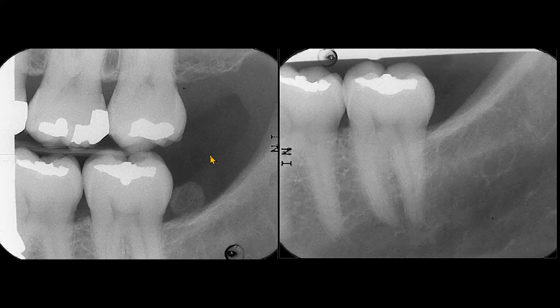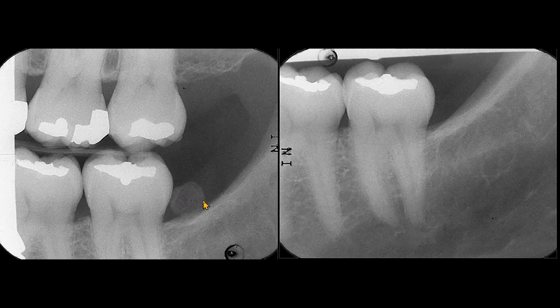We have two intraoral radiographs: a bitwing and a mandibular left molar periapical radiograph. Unfortunately, both radiographs have some cone cuts. These cone cuts are not preventing us from observing the circular or oval radiopacity. On the bitwing radiograph, this radiopacity appears to be in contact with the alveolar crest. However, on the periapical radiograph taken on the same day, we do not even see the radiopacity.